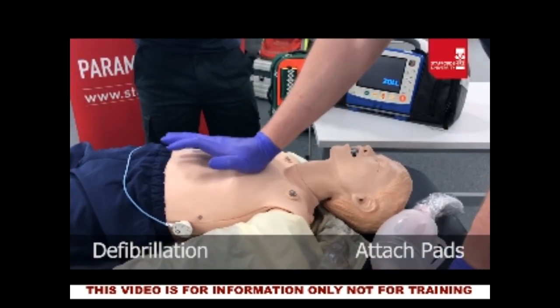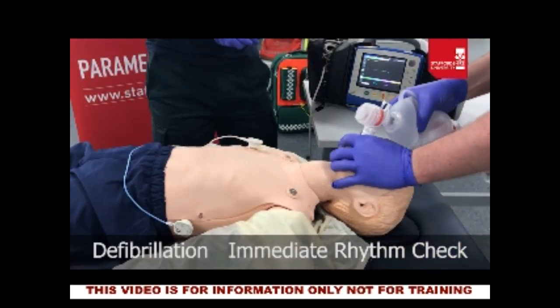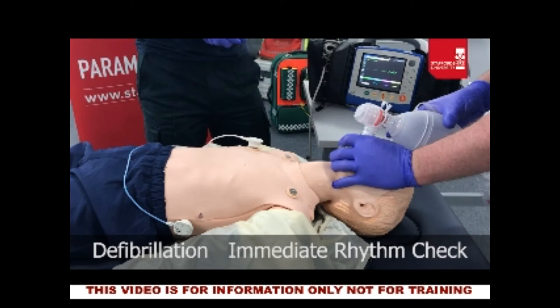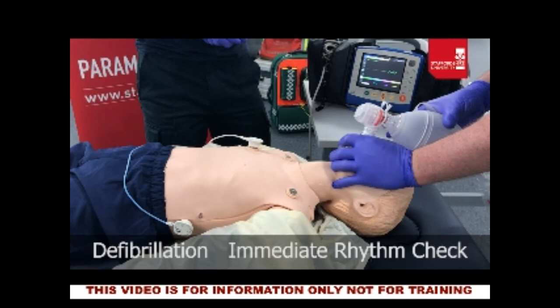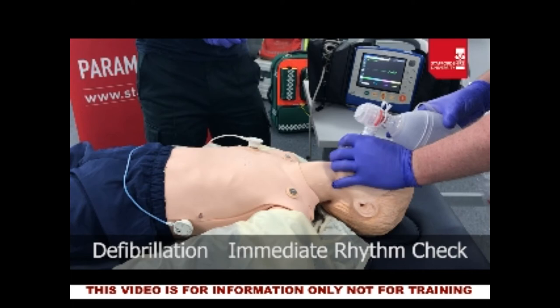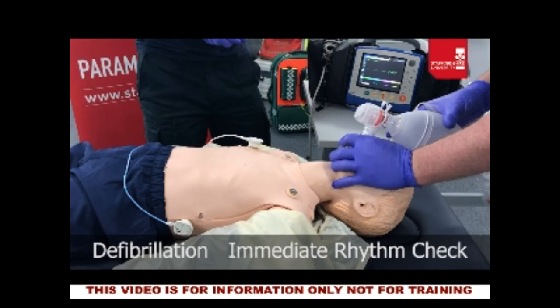On this occasion due to the size of the patient we use the standard pad placement. Once pads are attached, switch on the defibrillator and do a rhythm check as soon as possible. According to Resuscitation Council guidelines, this initial defibrillation attempt takes precedence over everything else including a blocked airway. Every subsequent defibrillation attempt and rhythm check is secondary to an airway problem. Research suggests that the initial defibrillation attempt is by far the most successful at returning the heart to a spontaneous circulation rhythm.